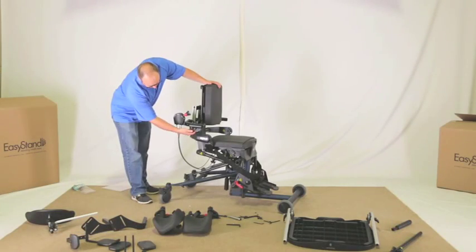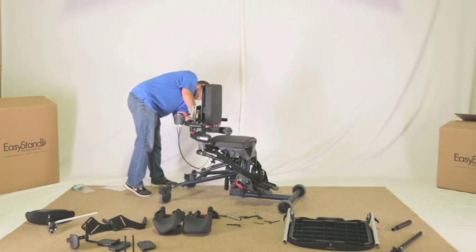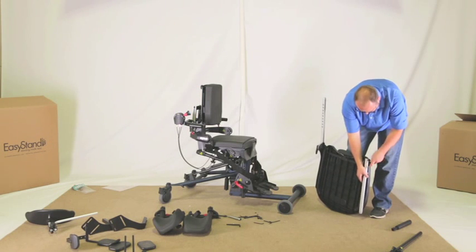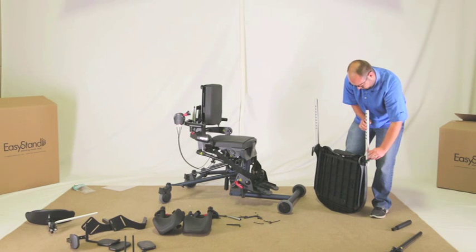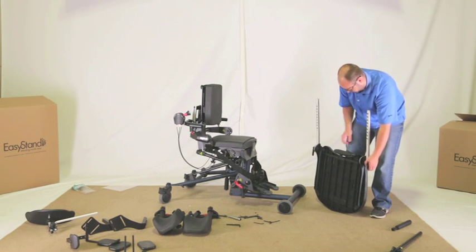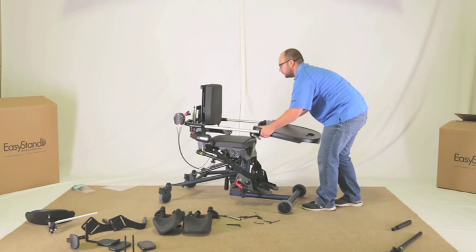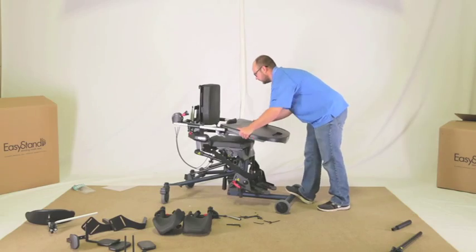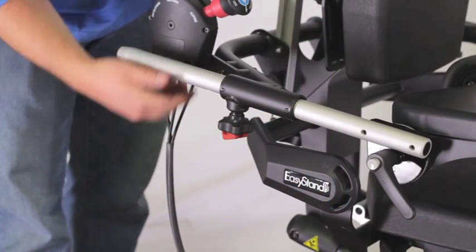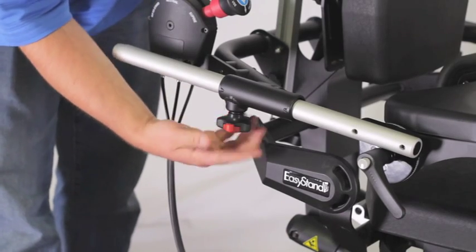If the optional shadow tray was ordered, loosen the knobs on the tray tubes on the side of the back. Loosen the ratchet handles on the side of the tray, flip the arms up, and tighten the ratchet handles. Making sure the rear casters are locked, insert the two tray arms into the tray tubes on the unit. One of the arms is longer than the other for easier installation. Tighten knobs on the tray tube securely. You may need to pull the tray tube to lock into position.